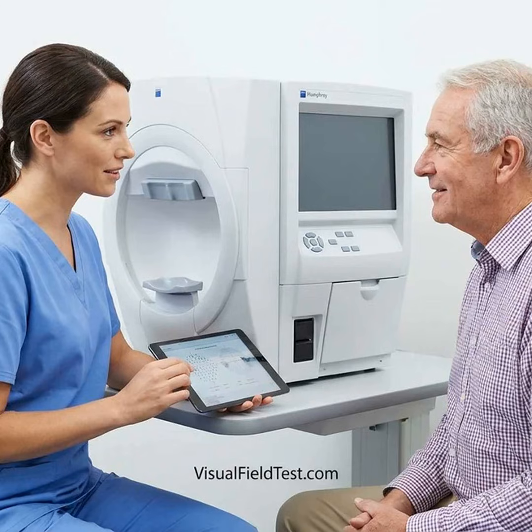Conclusion: patient education is a low-cost way to improve visual field test performance. The strongest evidence supports a brief educational video reinforced by clear verbal instruction, teach-back, reassurance, and a short practice demonstration. Across available studies, structured education improved the proportion of reliable tests by approximately 14.5 to 20.8 percentage points, while effects on test duration were smaller, generally a few seconds to less than 1 minute and not always statistically significant.